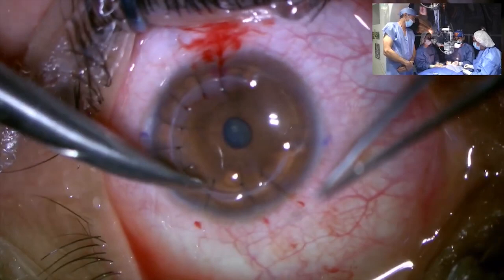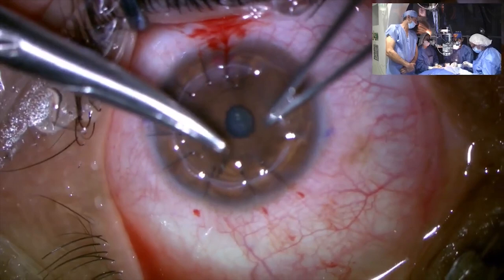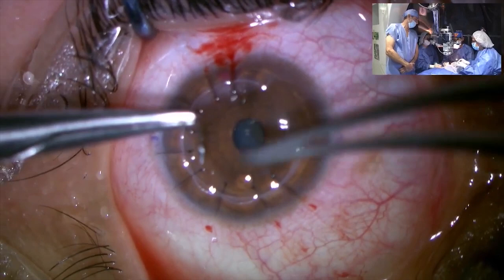As Dr. Carriazo said, it is very important to distribute the sutures so that there's not a big gap between them, because we don't want the cornea bulging out. Exactly. We want a very even distribution on the cornea. Here, as you can see, the cornea is bulging out a little bit. So I'm going to place a suture in that area to make it much more even. Okay.